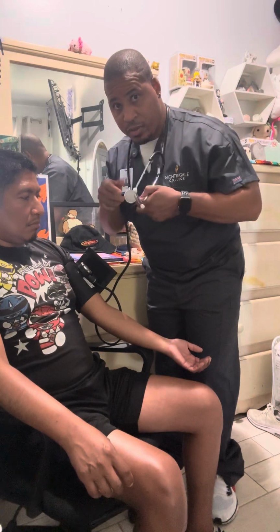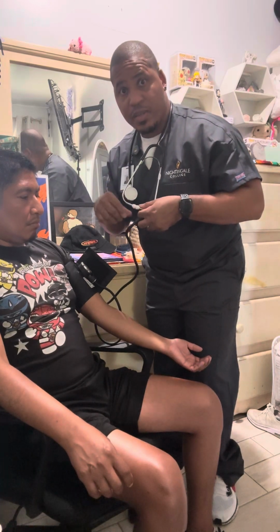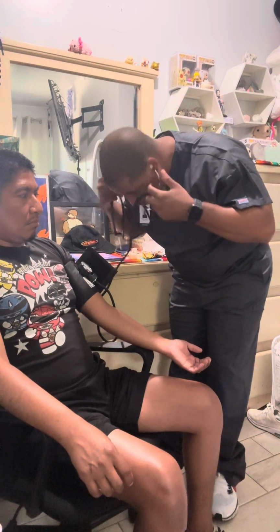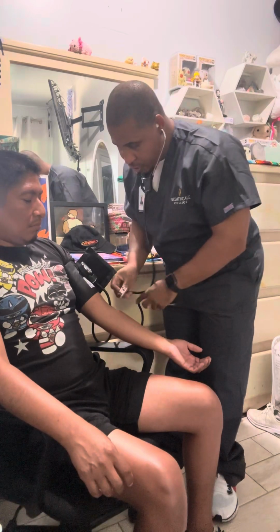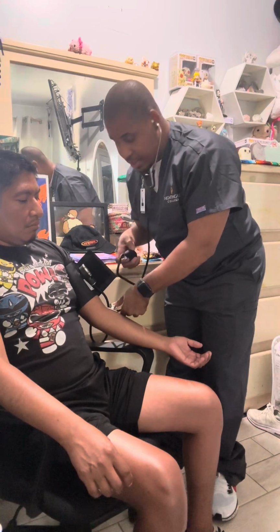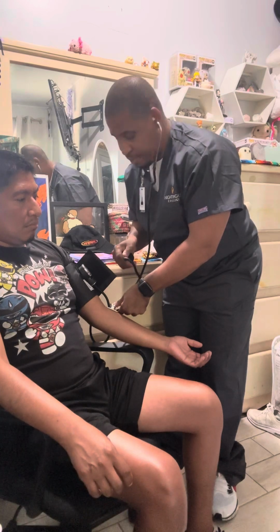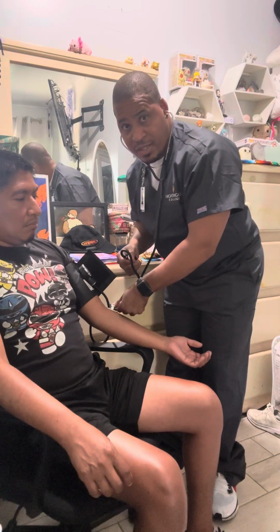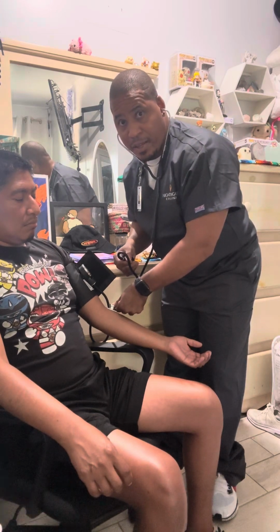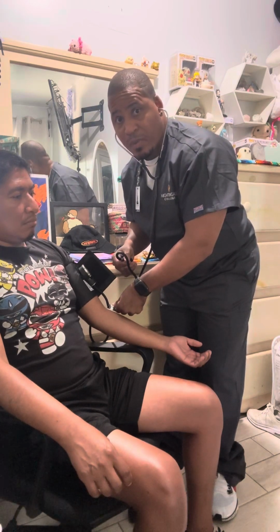I want to wipe down the earpiece part right here with alcohol wipes. Place the diaphragm on the area where I located the brachial pulse. And I want to pump this all the way to 150. I'm looking for the systolic, and that's the first sound that I hear. And then the next one will be his diastolic, which will be the bottom number.